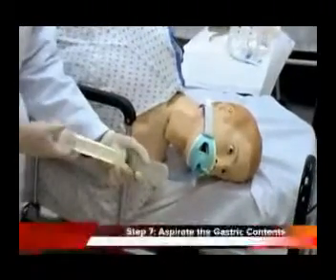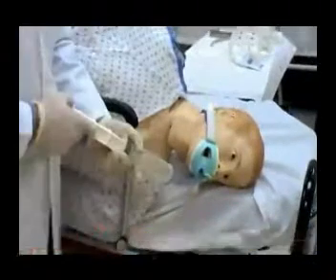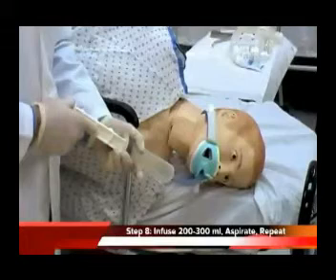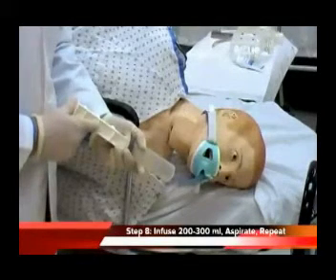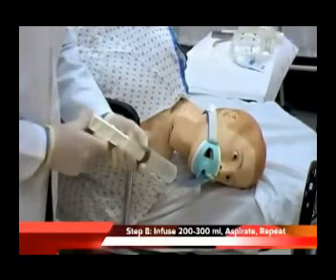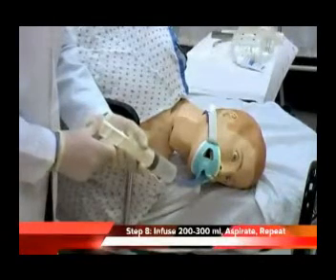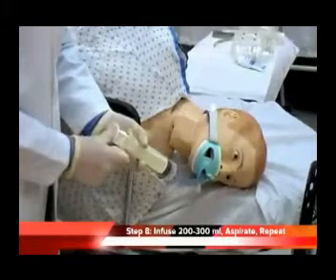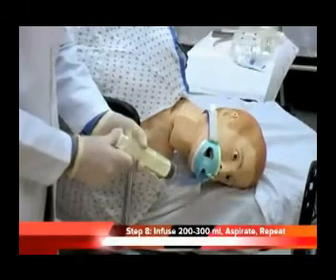Step 7. Aspirate the gastric contents. Step 8. Gently infuse 200 to 300 milliliter aliquots of warm water or warm normal saline. In children, use 10 milliliters per kilogram of warm normal saline. Aspirate the fluid back out. Do not irrigate with force. You do not want to push the drug into the small bowel where more absorption of the drug will occur.